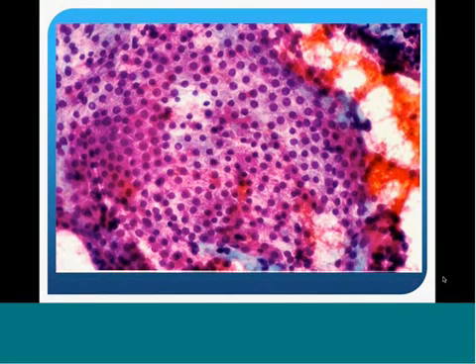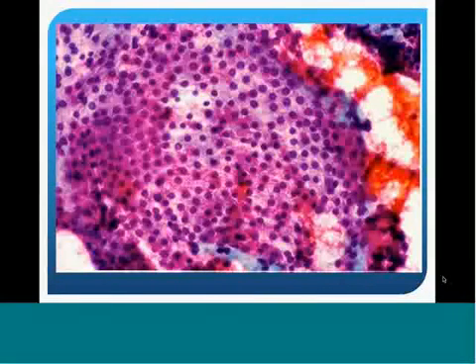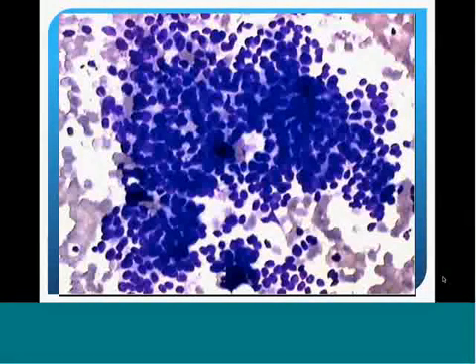These cells are all uniform in size. There is no great degree of variability in their size, in their architecture. It looks very straightforward, very neat. Whereas in this picture, you have a kind of confusion, overlapping, irregularity of nuclei, which may indicate that something else is going on, something neoplastic.